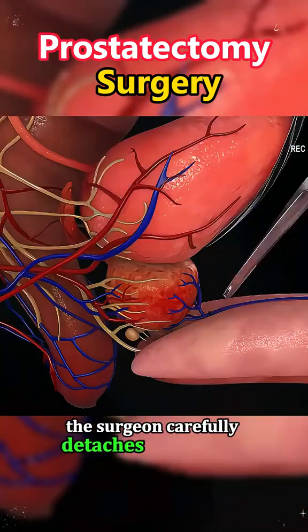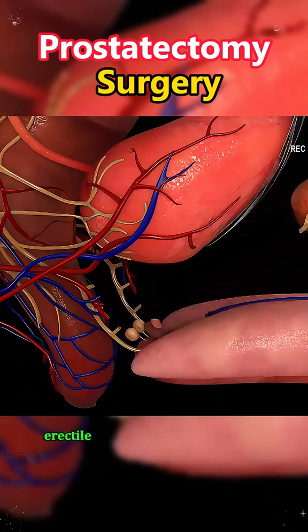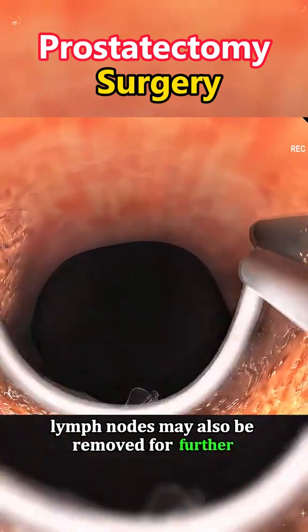The surgeon carefully detaches the prostate gland from the surrounding structures, paying close attention to the nerves and blood vessels responsible for erectile and urinary function. If necessary, nearby lymph nodes may also be removed for further cancer analysis.